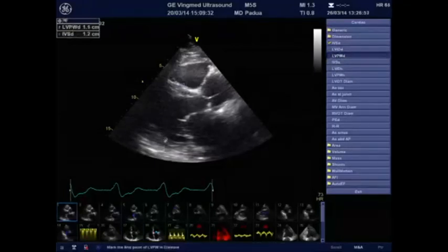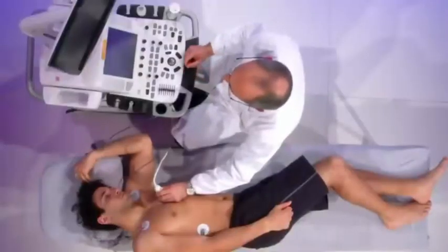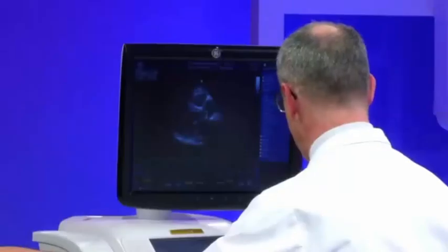This is really important because this measure, when compared to the previous one, tells you if there is any thickening of left ventricular walls. That is one of the first hints that an acute rejection may occur.